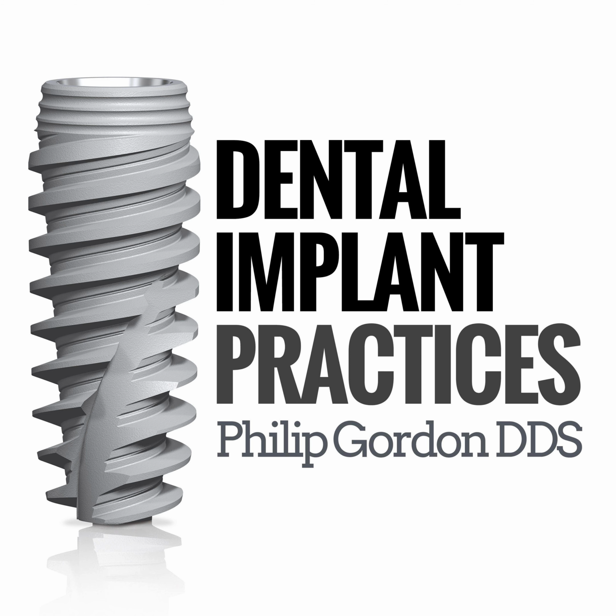Okay, great. So let's break it down into two categories. You've got maybe one or two teeth, and you've got a whole arch. So when it comes to single tooth replacement, what are some things like if I want to do guided surgery? Most of your clients, dentists, maybe send you upper and lower models, a bite registration, maybe a face bow transfer, a copy of the DICOM for the scan, and is that where the case starts?